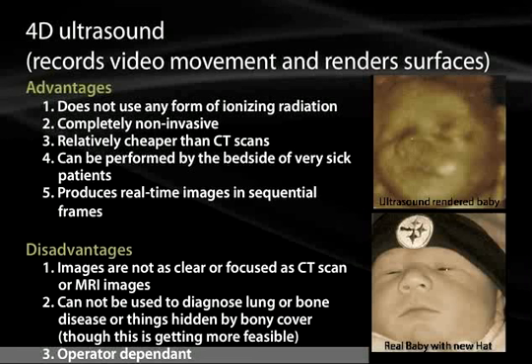So here you can see an ultrasound rendered baby. So this is surface rendering from just sound itself. And then the actual baby, after it's come out, you can see the resemblance is quite astonishing, other than the hat, of course, which I'm sure they put on after it came out.